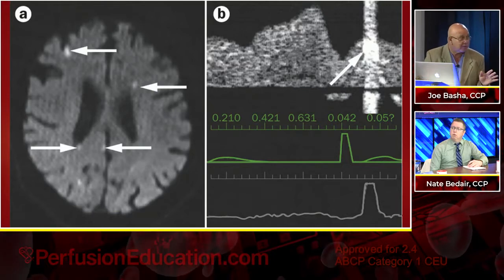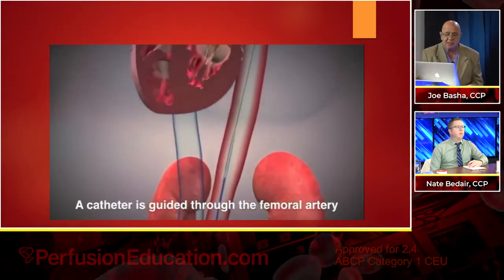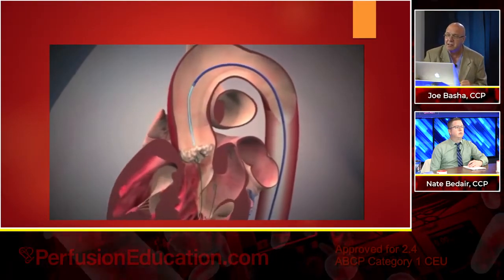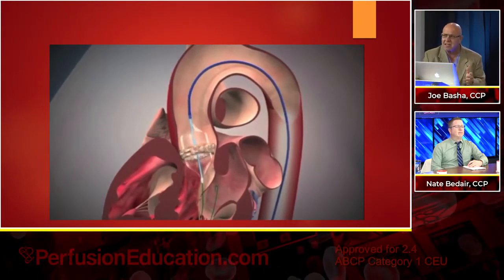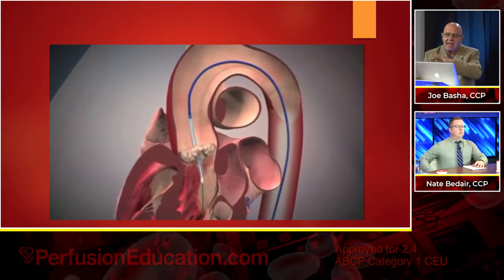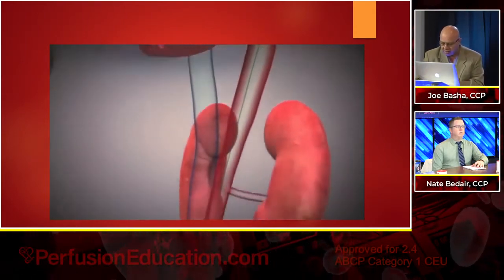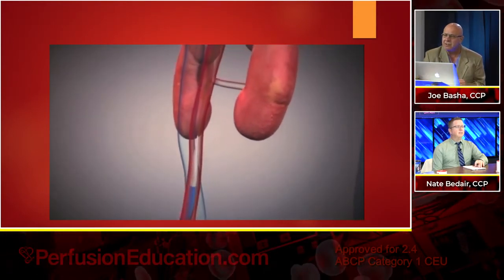We don't do anything to fix it. So these new industries have been launched. Take a look at this. This is a cerebral embolic protection device. No, that's not. This is a TAVR. I lied. This is a TAVR. You see it going in. You see how it's staying central lumen. They just dilated the balloon. It all looks great, right? Except for the embolic shower from the... Well, let's watch.